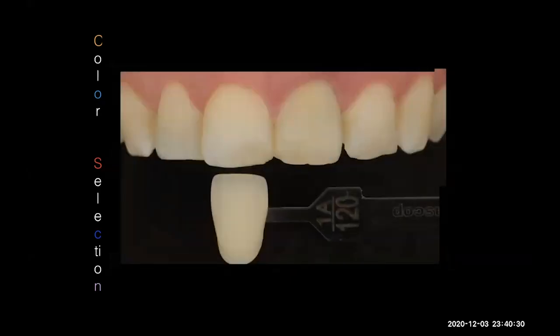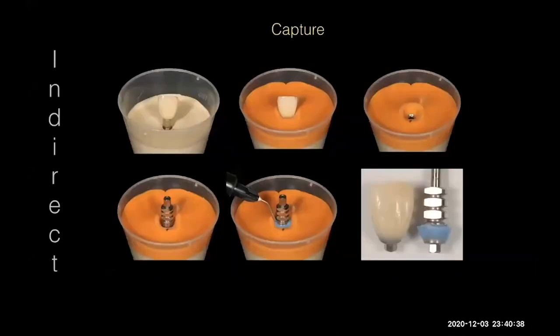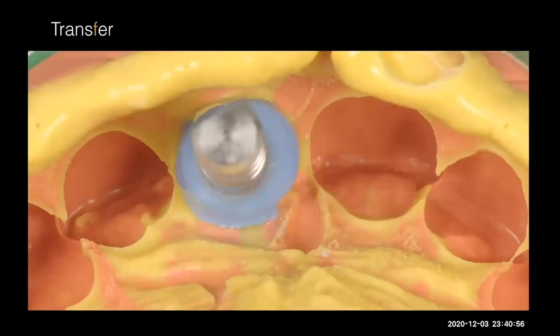So what happened now? Now we have the polarized picture. He sent me all the information because we are working from a distance, from Mexico to Miami. So he does the indirect technique to capture the soft tissue emergence profile. When he captured the profile, he went to the mouth, placed the impression coping, and then took the impression. He sent me everything.